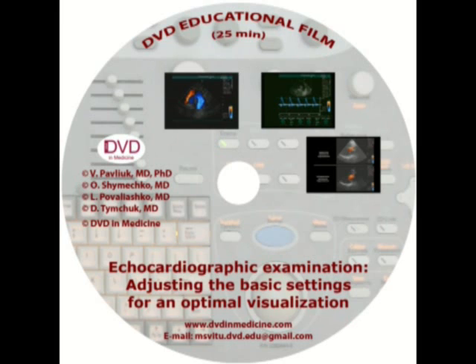Despite the efforts of the manufacturers to automate and simplify things, it is still necessary to continually adjust many of the scan and Doppler parameters during the course of an examination. The purpose of this film is to visually show how to make the fine adjustments of the basic settings during the course of the echocardiographic examination.